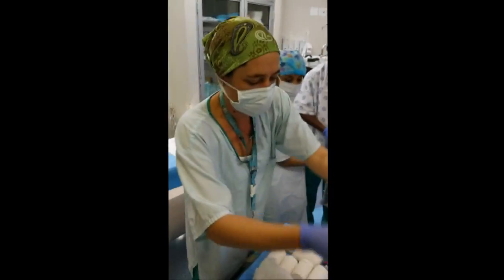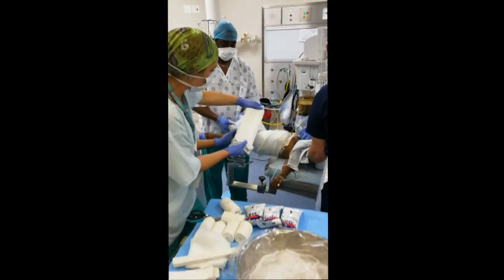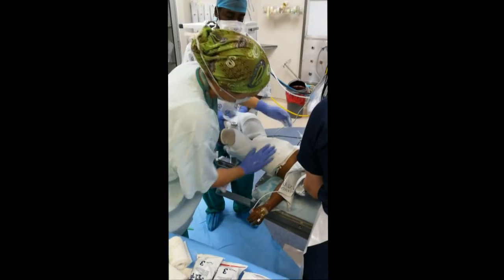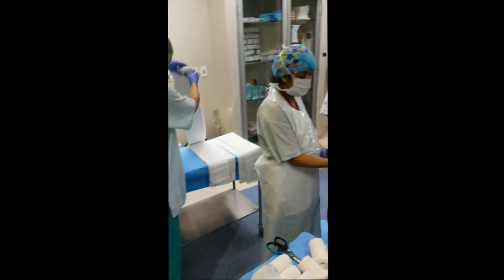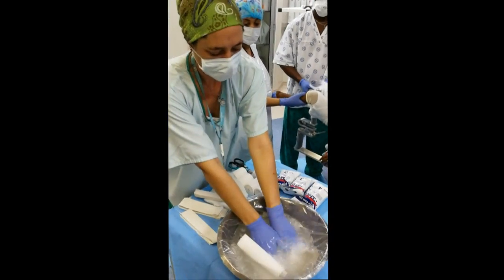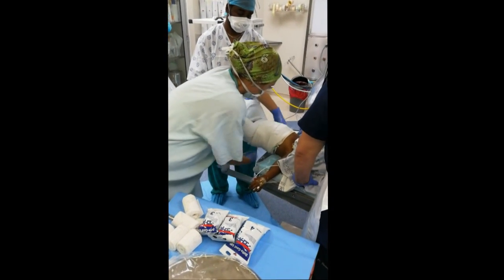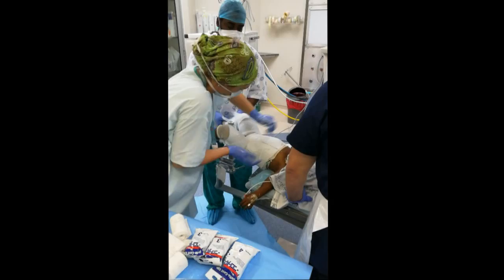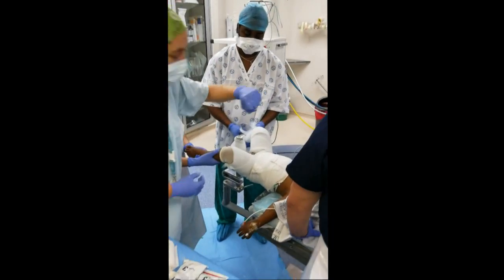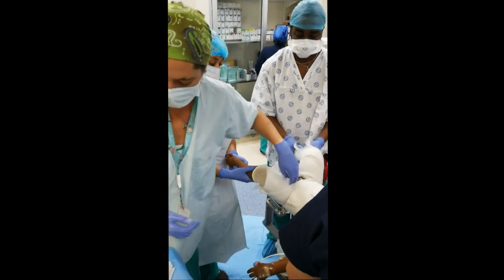Start with your first 150mm slab, wrapped around the patient's body. We'll do this with two sets. Before you start applying the legs, just make sure you're happy with the position again. You need to be able to put a fist in between the spica cast over the perineum so that there's enough space for hygiene and for the diaper to be applied.